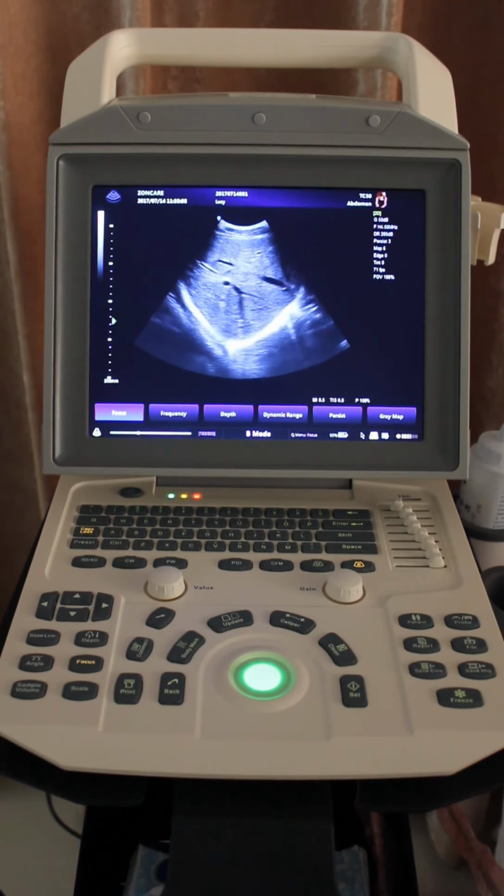When we press the value button, we can see there are more measurement parameters like tint, and also like the edge, gamma, contrast, brightness. We can use the value button to move to the corresponding menu. And if we want to adjust, then use left and right to adjust the levels. So much for the B mode measurement and the image adjustment.